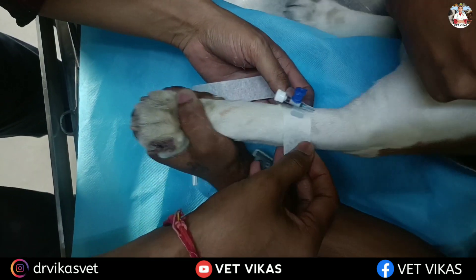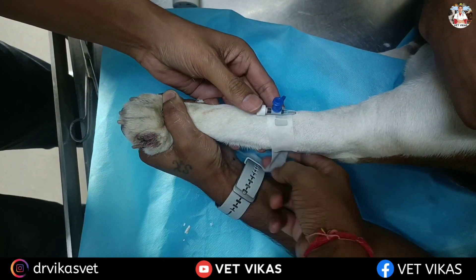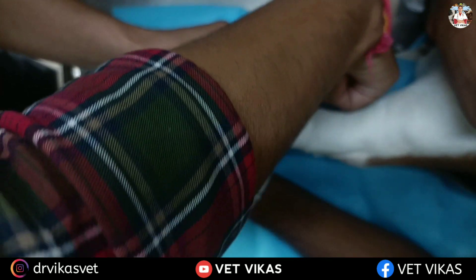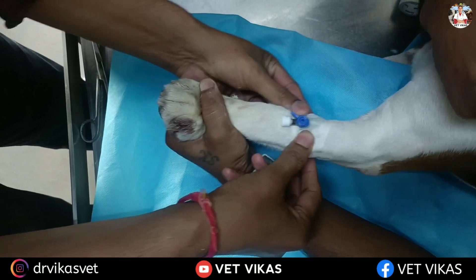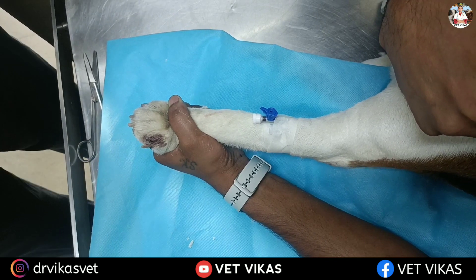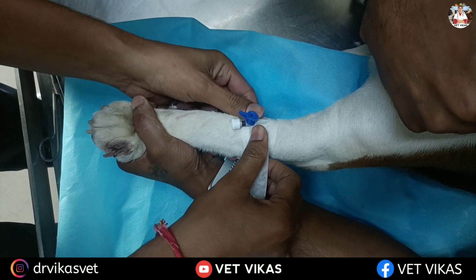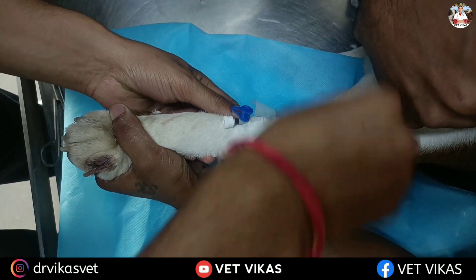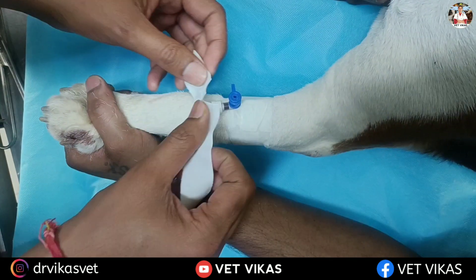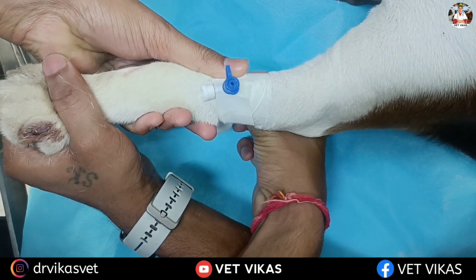Now we are securing the IV cannula. First of all you have to secure the entry point of the IV cannula. After that you have to secure the wings. For extra security, you can apply one more tape over the wings.